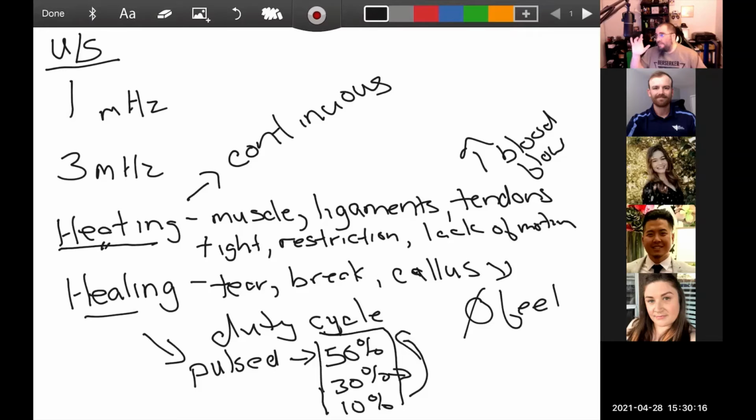So like if I've got trigger finger, I've got a tightness, right? I've got a bind down. So we're gonna have to do continuous for that.